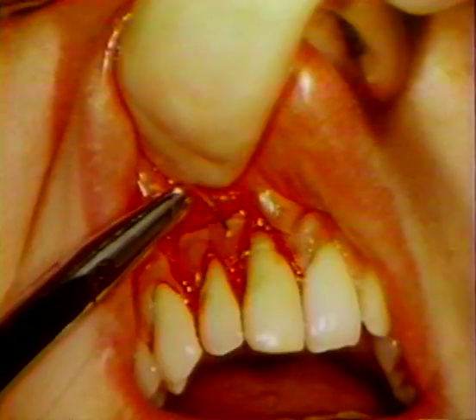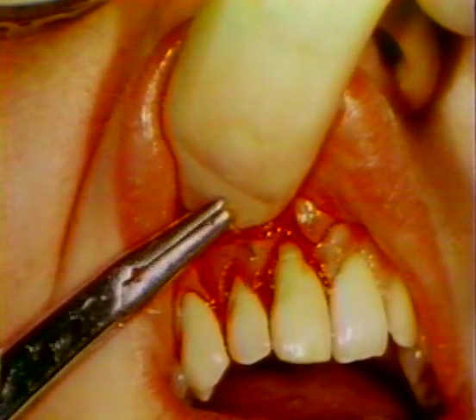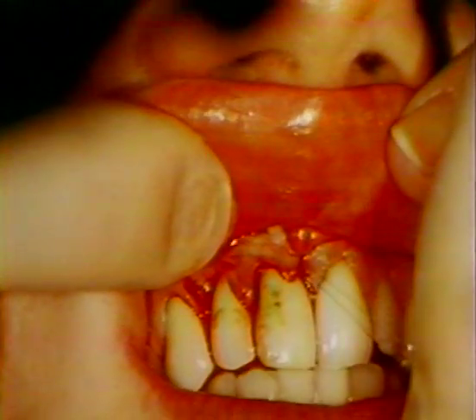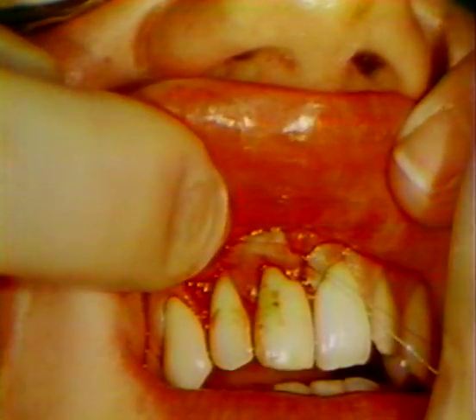A 5/0 silk suture is placed through the mesial aspect of the flap using a fine atraumatic needle. The flap is gently drawn to the desired position.